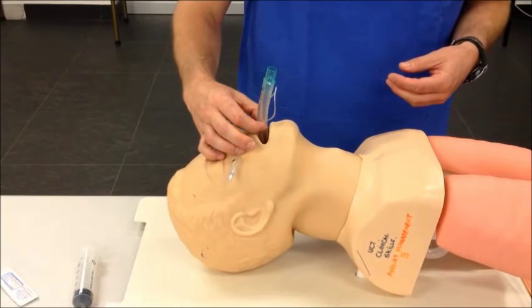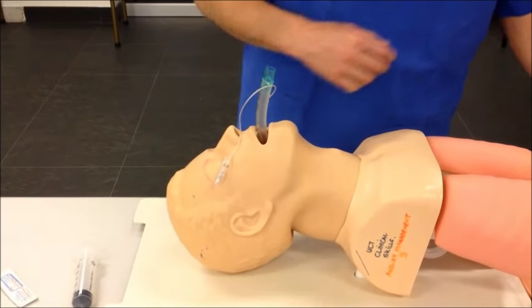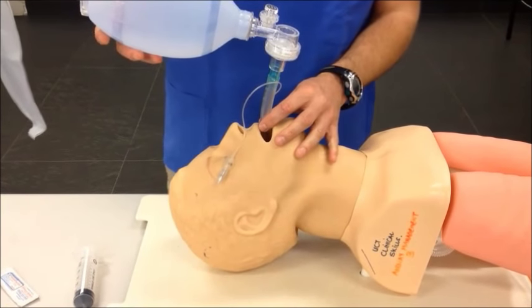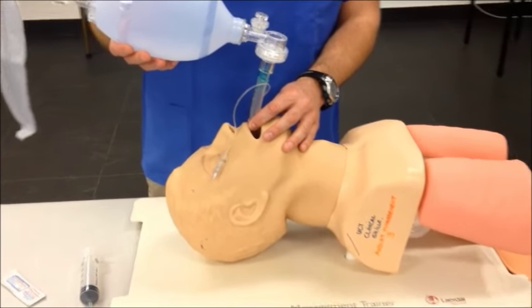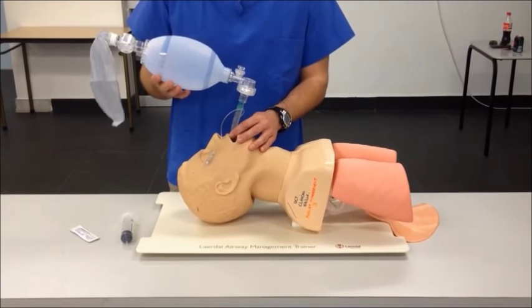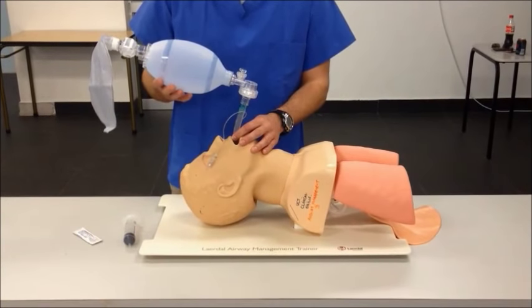Ask an assistant to secure the tube with their hands while attaching a ventilation device — in this case a self-inflating bag-valve device. Ventilate the patient, and confirm chest rise, and also listen into the epigastrium to see if there is any gurgling of air.